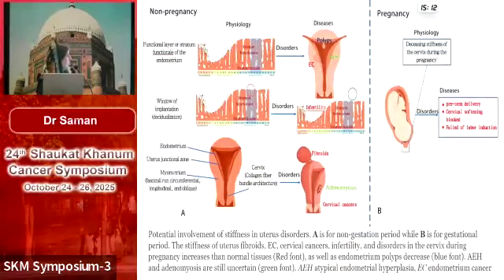So just to give you an overview of how this stiffness changes in different non-pregnant and pregnancy conditions. The conditions written in red are those in which the stiffness increases. Now, when we talk about the increase or decrease in the stiffness, please keep in mind that we are talking in reference to the normal myometrial stiffness, right? So in endometrial cancers, the stiffness increases. In fibroids, it increases. And in cervical cancers, the stiffness increases, and in various cervical pathologies in a pregnant patient.